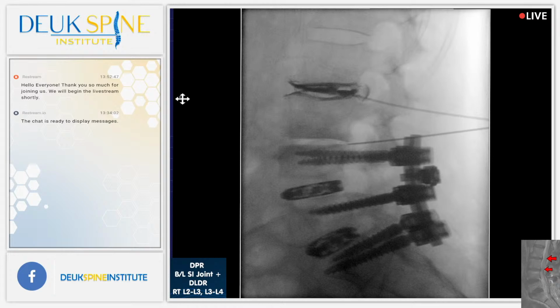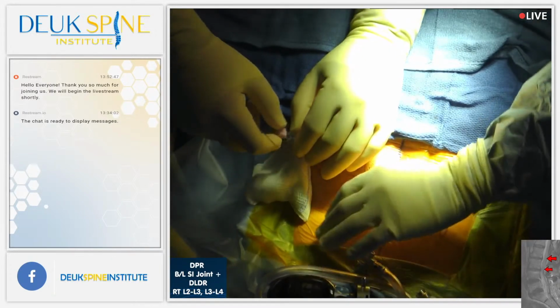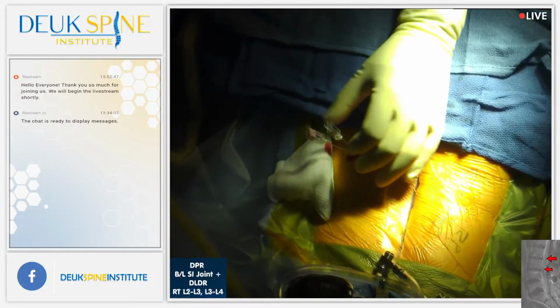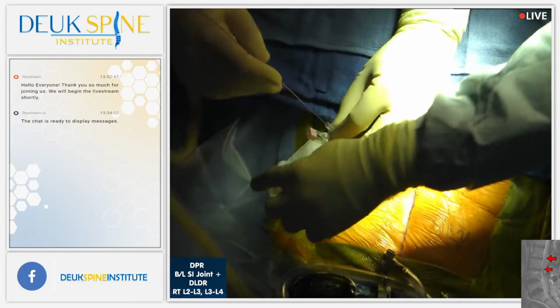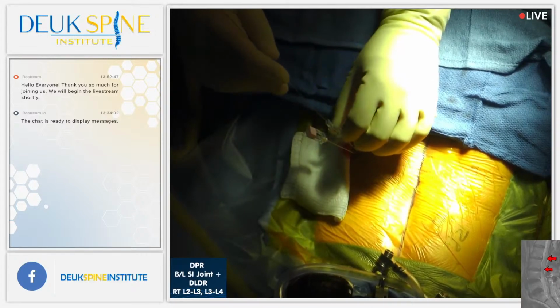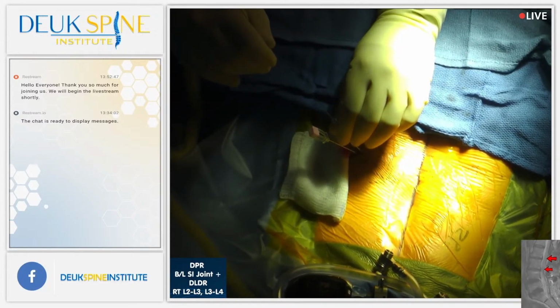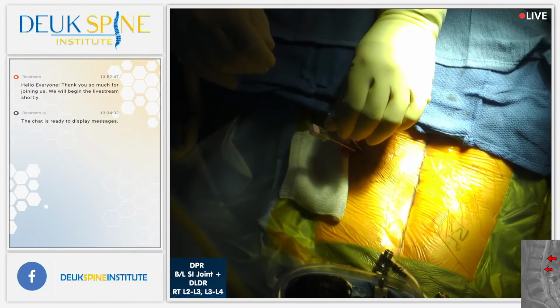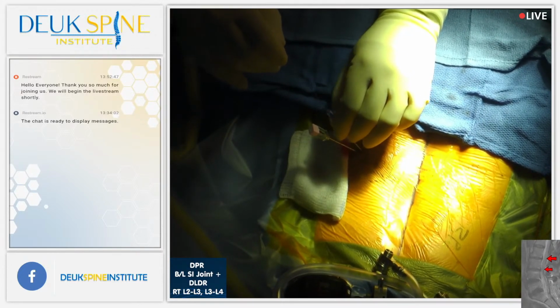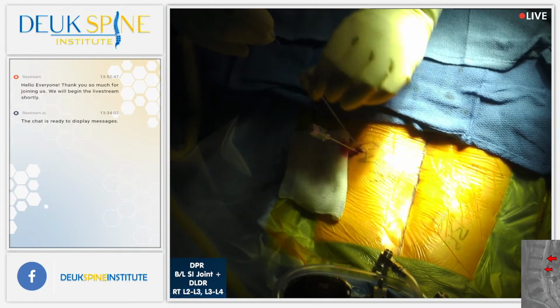All right. Berndes, everything good? All right. I'm going to get started if that's okay with you, Dr. Berndes. All right, feel free to ask us questions as we work. We've already made our incision. It's 1/4 inch. You're okay. Everything's going well. You're doing great. All right, we are now inside the disc with the guide wire.